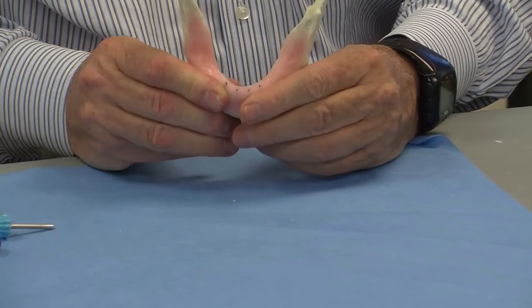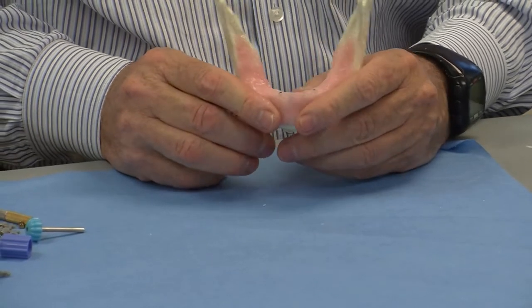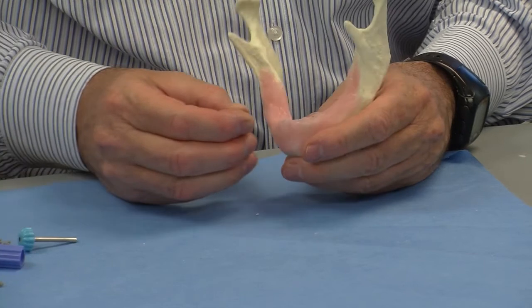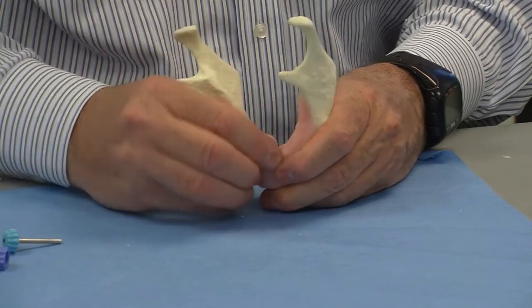The 4 implants are installed, and we're going to install now the locator attachment on top.